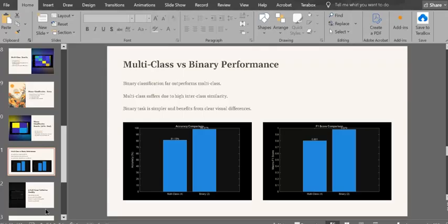The binary detection works well because the presence or absence of a mass creates strong differences in the shape, contrast and the texture, which handcrafted features can easily capture.